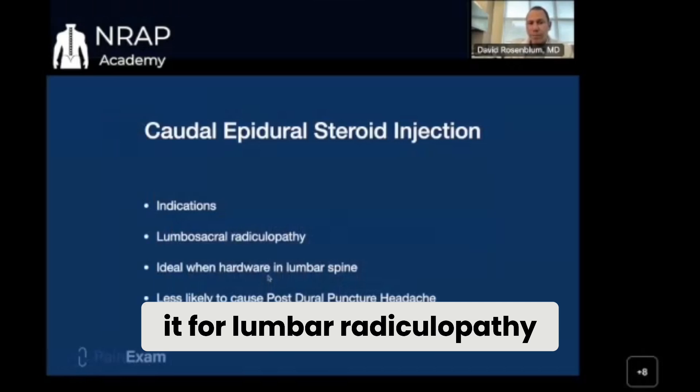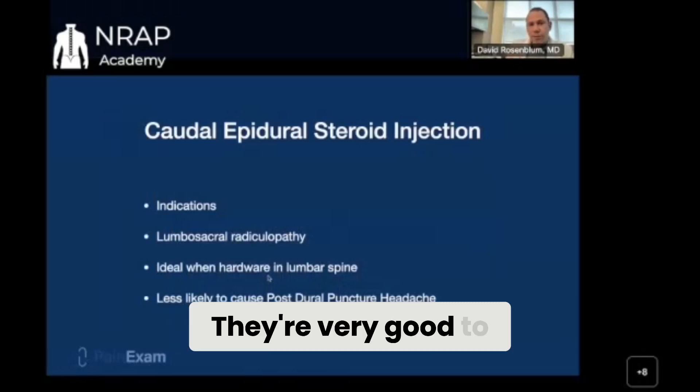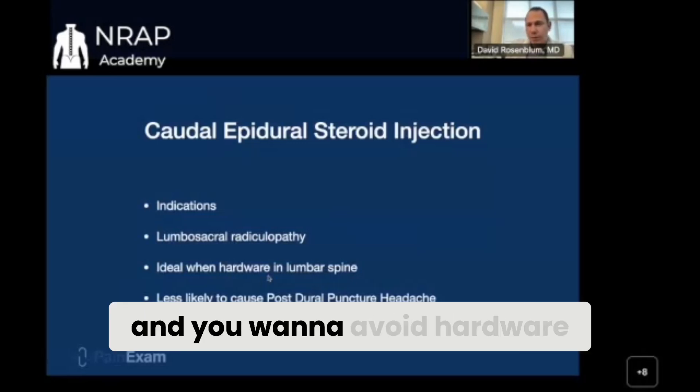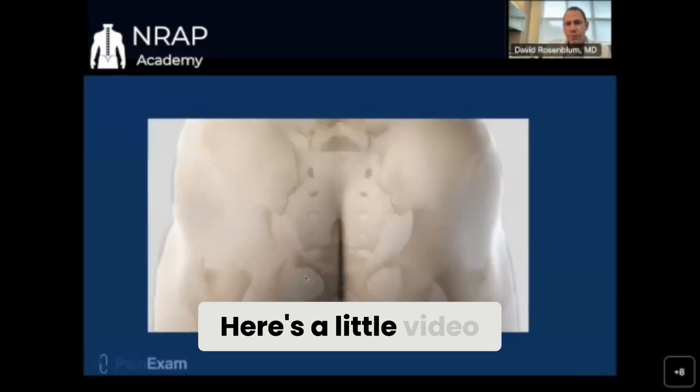Caudal epidurals — we use them for lumbar radiculopathy. They're very good to avoid lumbar punctures, for postoperative patients, and people with failed back syndrome where you want to avoid hardware. Here's a little video on it.